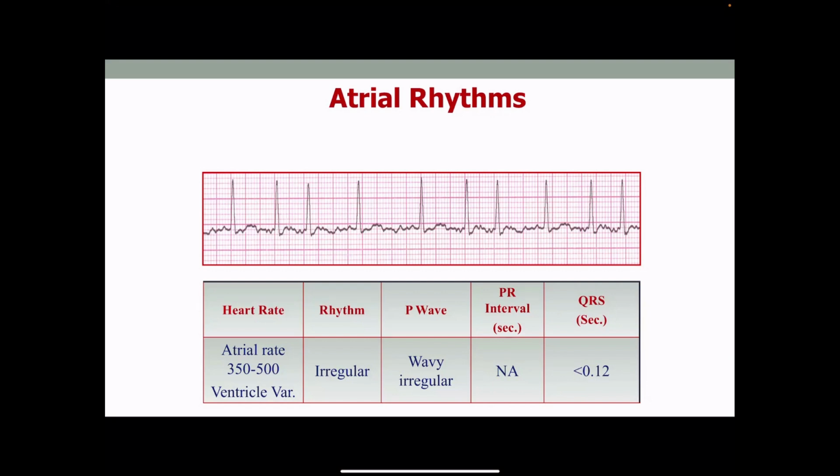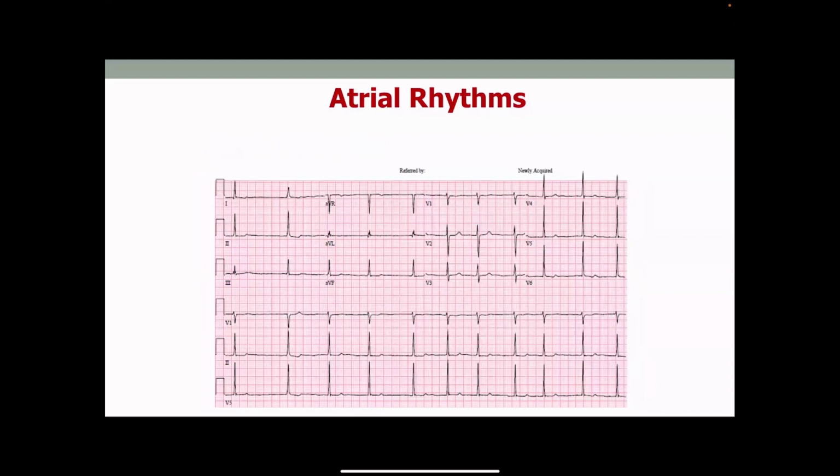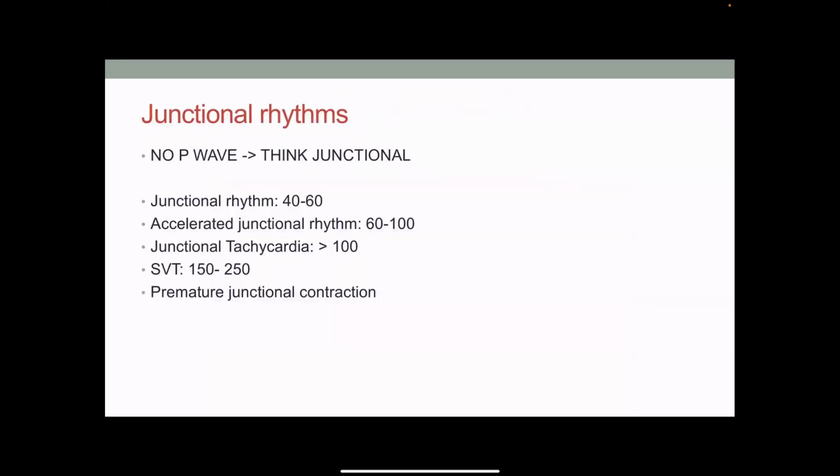Atrial fibrillation. Exactly. Yes, you have vibrations, vibrations, vibrations, and then a ventricular contraction, then vibration, so AFib. This is also how it looks, okay? Just be very familiar with how it looks. What about this one? Same, also atrial fibrillation. Yes. I put them after each other because I don't want you to hesitate if it's the same thing.